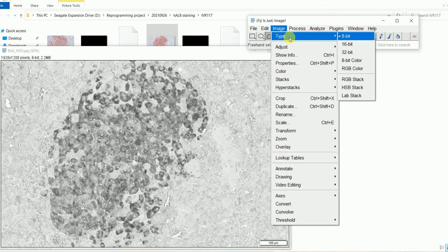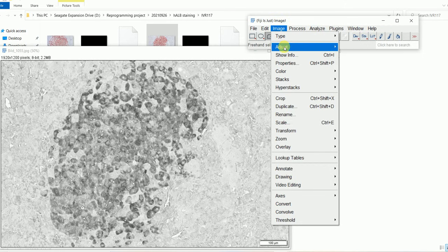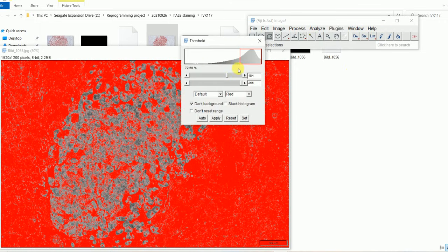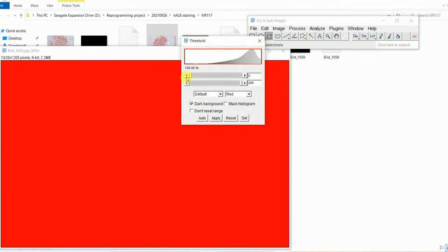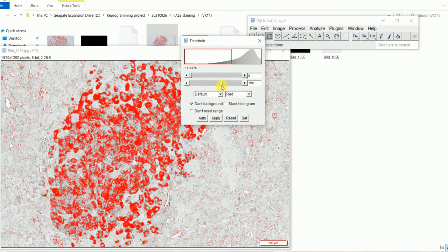Right, so then what I have to do is go to Adjust. After this image has been converted into an 8-bit image, I go to Image, then Adjust, and then I will go to Threshold. I'm just going to click on Threshold. Then I will just drag it like this, and I'm going to keep the default here, and here I'm going to keep red. Then I'm going to slide it down so that I can only see that here I have some backgrounds. Let's see, yeah, so if you look here, I'm just going to drag it here.